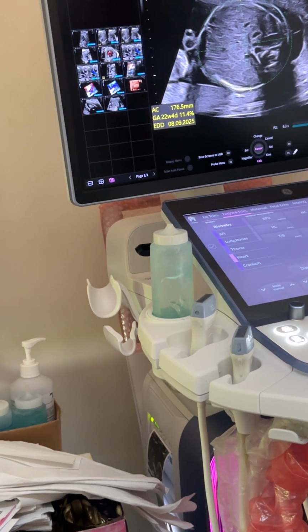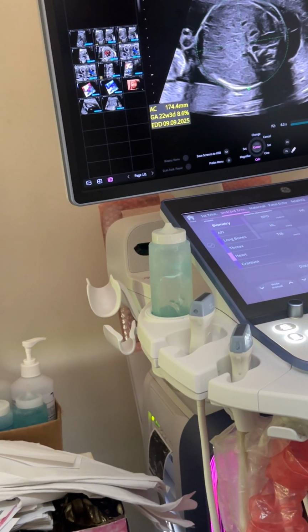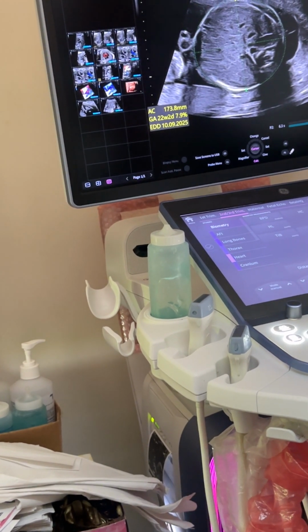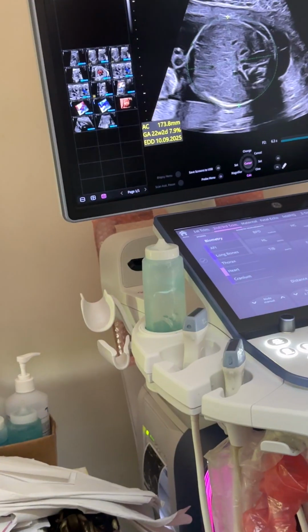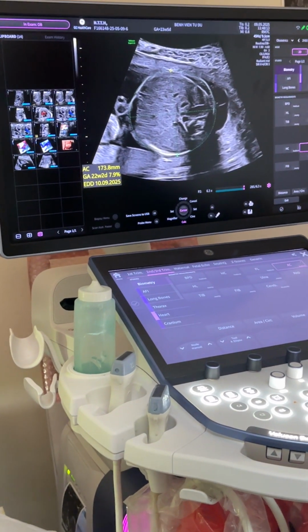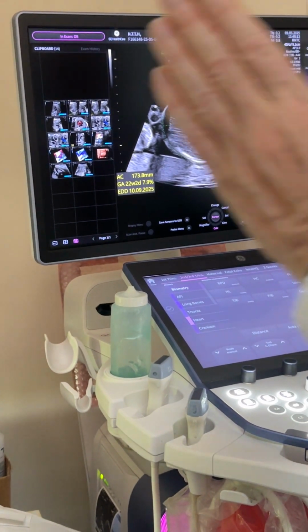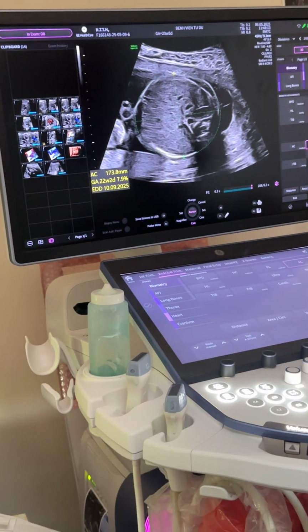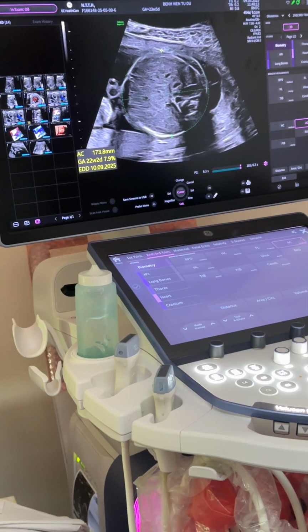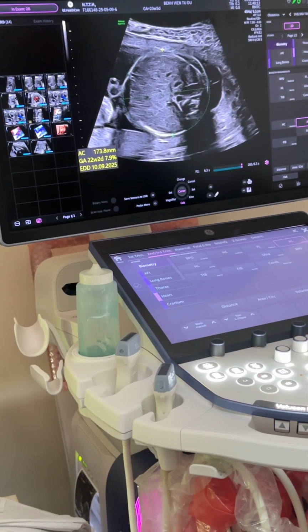And when the baby's moving, I can then change the image until I'm happy that it's inside. And when I have the image with the baby moving, I then switch from one twin to the other twin, and I make the other twin's AC fit inside. It's a very quick way for me to get a visual of how one twin's AC compares to the other. You say, Simon, why do you do that? You can measure an AC and that's 21, and that AC is 17. I say if you do hundreds of ACs the same way, you very quickly know which is the one you worry about, and not a measurement.